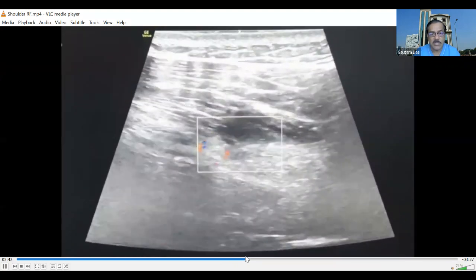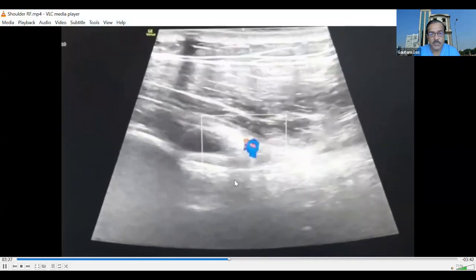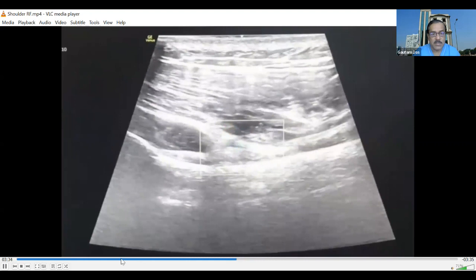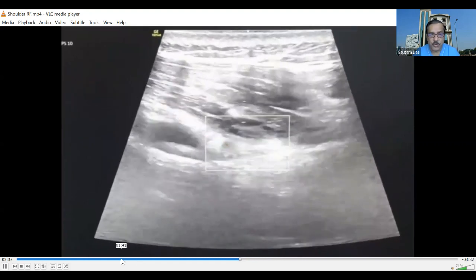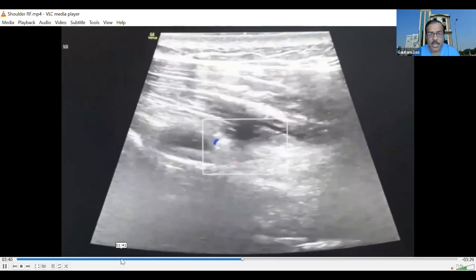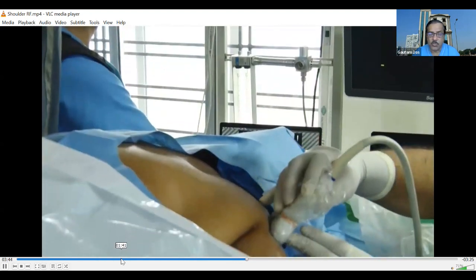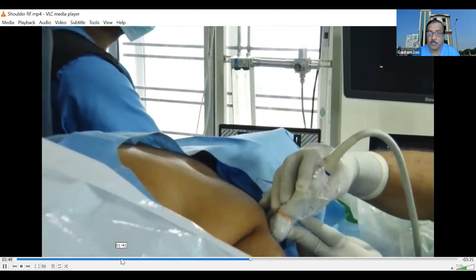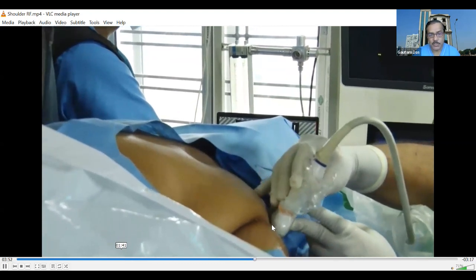We can see the shaft of the humerus clearly, and as we move the probe laterally, the shaft of the humerus vanishes. But the arterial pulses remain visible. At that point, the axillary nerve has already given off its muscular branches, and only the articular branches — the terminal branch of the axillary nerve — remain. The probe is held in this lateral position for targeting.